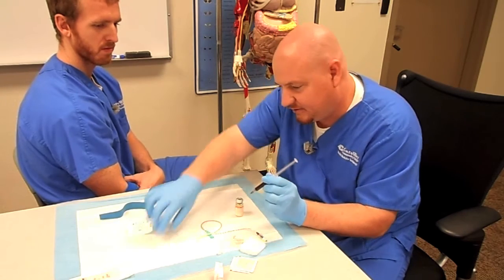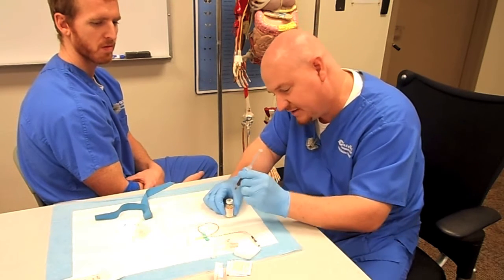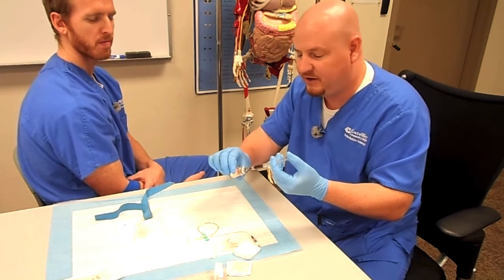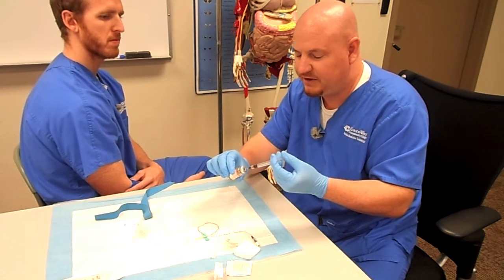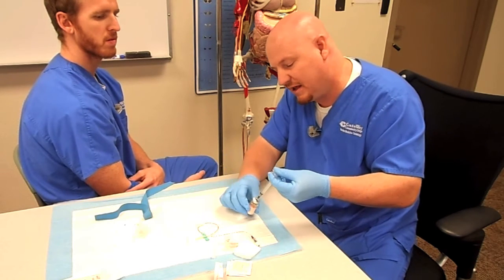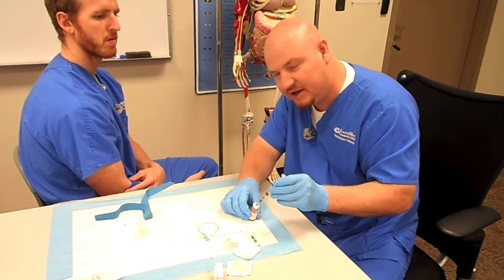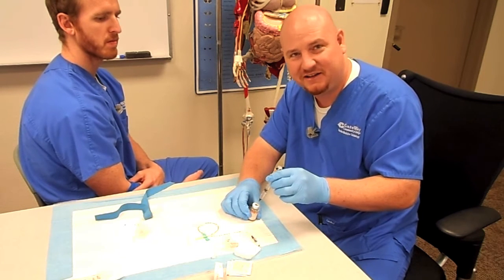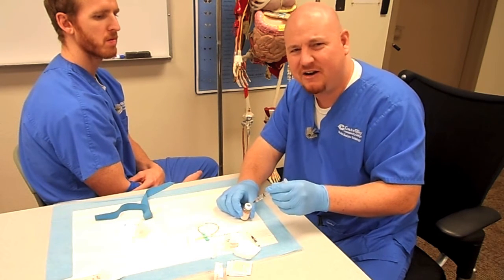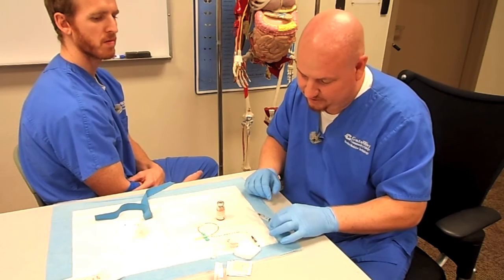To inject into the reaction vial, take some alcohol and make sure it's clean. Once that evaporates, puncture the vial and push in the blood. Now remember, this vial was filled with argon gas, and now we're adding more volume into it. So once you inject the blood, you can pull the needle up a little bit and pull a little bit of air out of the vial into your syringe, so that you're not building up a lot of pressure inside the reaction vial. Because this is blood, and sometimes if you get too much pressure in there, it can squirt a little bit at you when you're taking the needle out — and you really don't want that.